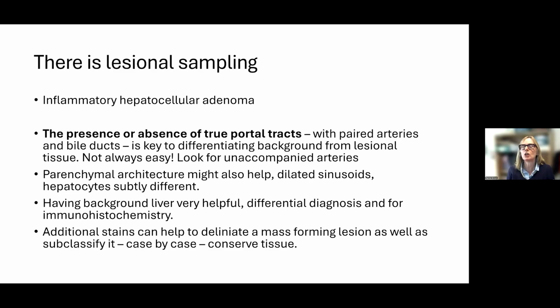Of course, you're going to take every case on its individual merits, and you're going to make judgments about how much tissue you've got. So think carefully before you ask for those additional stains, and don't waste tissue doing hepatocellular markers when you're clearly looking at something that's obviously hepatocellular.